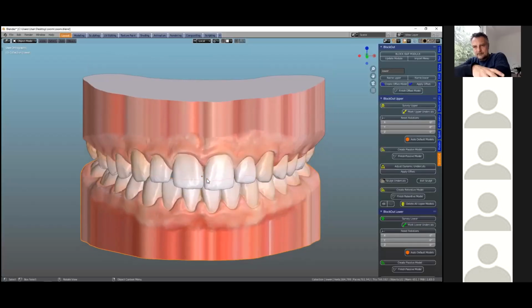Down to it. When we make a splint in a laboratory, Wolfgang, can you explain what are the steps that we actually take? We are doing exactly the same in digital. Yeah, well, it follows the same process, making the model. Of course, you've got to articulate the model. You've got to block out the undercuts or create sufficient areas that the splint can hold onto. And then you make the splint. And finally, you make the layer, and then you take it off the model, which is the very last thing, creating the inner fitting surface.